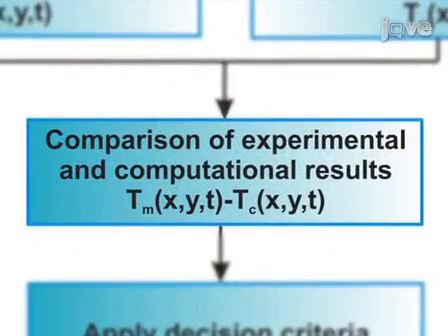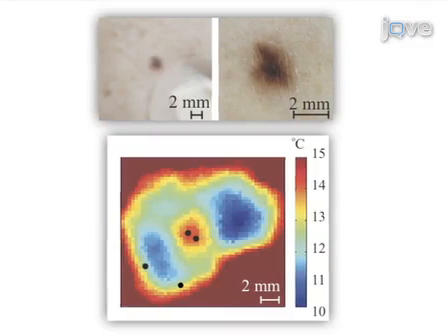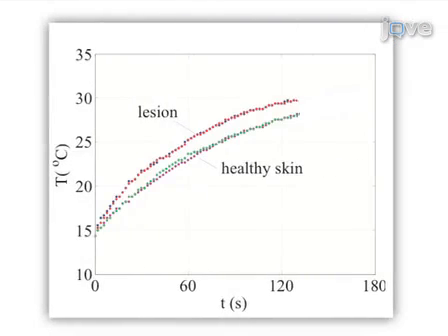Compare the skin temperature at the location of the lesion and far away from the lesion to evaluate differences in the thermal response as an indication of increased metabolic activity that may be related to skin cancer. Ultimately, results can be obtained that show heat generation through dynamic thermal imaging.